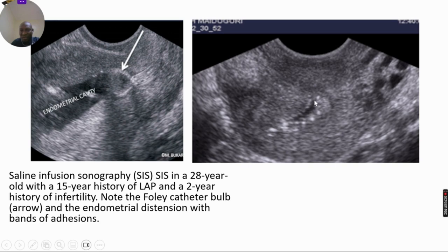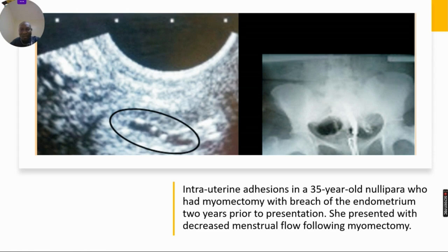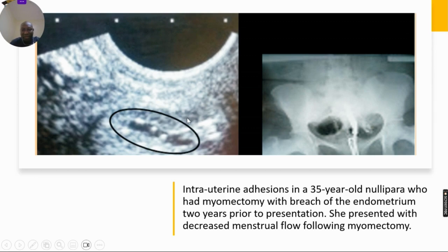This is a different patient. Note the irregular endometrium and look at this band of bridging appearance crossing the uterine cavity. Note this bright spot of subendometrial fibrosis. This patient had a myomectomy and presented later with reduced menstrual flow. It was difficult to even distend the endometrial cavity. Look at the reduced endometrial cavity and this bright spot crossing from one end to the other — this is also shown on SSG: iatrogenic intrauterine adhesions following myomectomy.